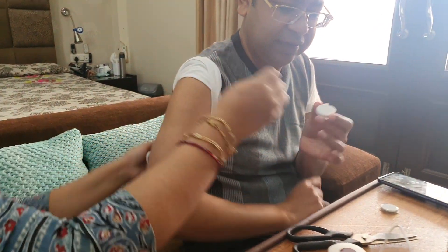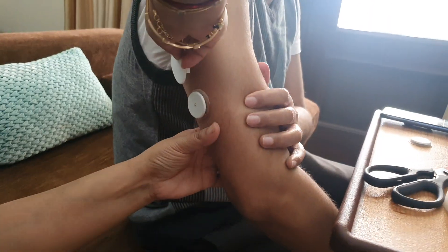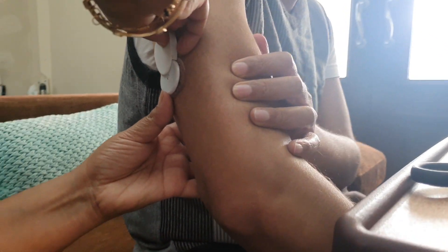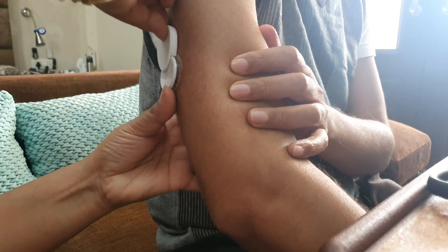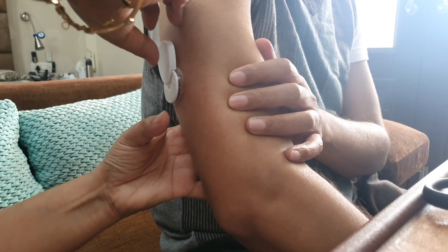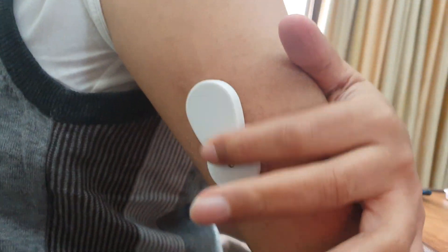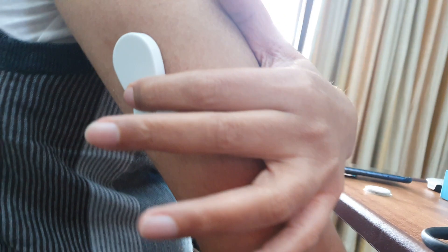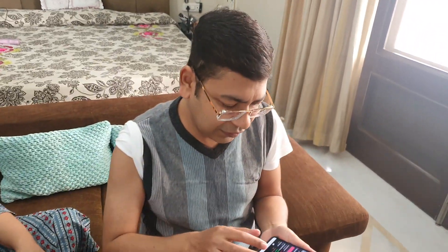Now we have the tape ready. I'm going to hand it to my wife and she is going to put it on my arm. The only thing she has to ensure is that there is no gap. Once done, it is now stuck to the sensor nicely — as you can see, this tape is pretty solid.